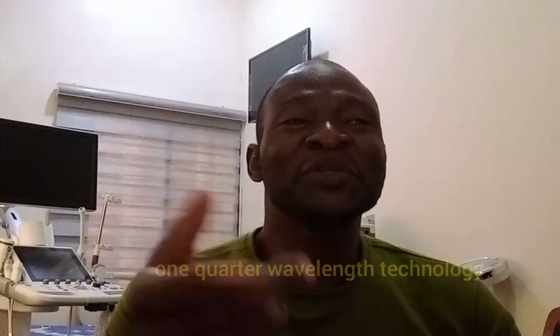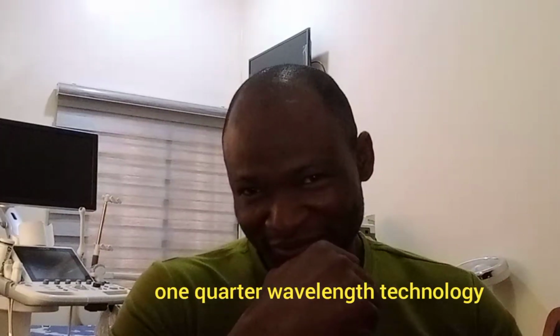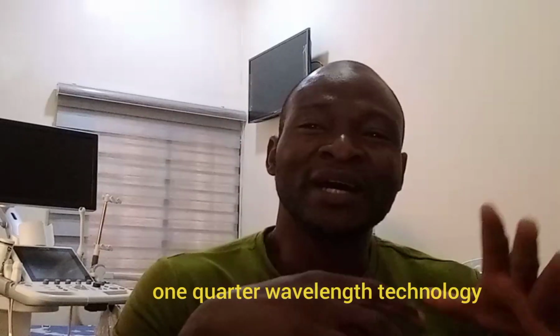So let's look at quarter wavelength technology. All these are applied to give the kind of quality of image. So what does quarter wavelength technology mean? Manufacturers found that the most efficient thickness for a matching layer is one quarter of the wavelength of the ultrasound pulse, and it's called quarter wavelength technology. The quarter wavelength matching layer is used for one frequency only.